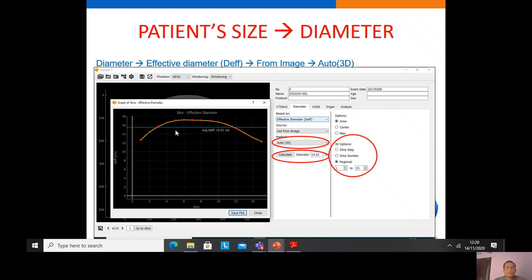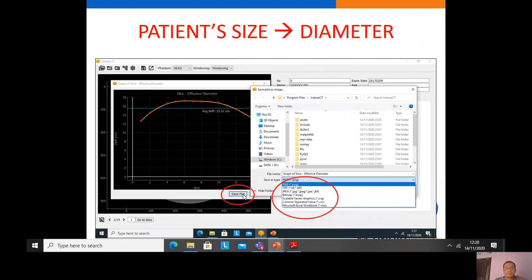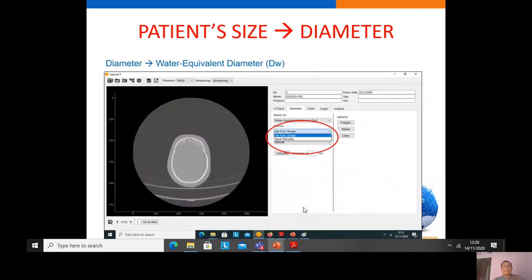We can save this curve in PNG, TIF, JPEG, or bitmap format, or export to Microsoft Excel.